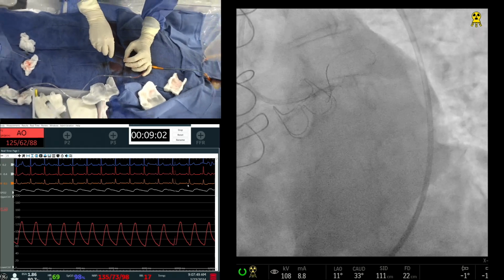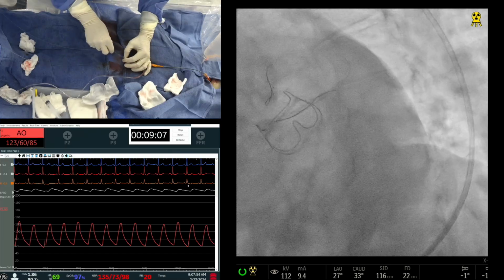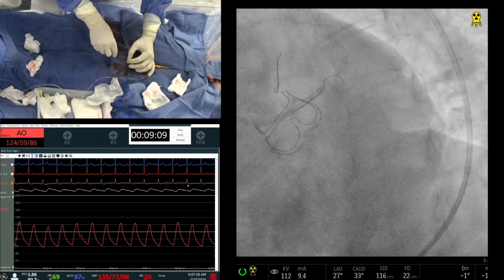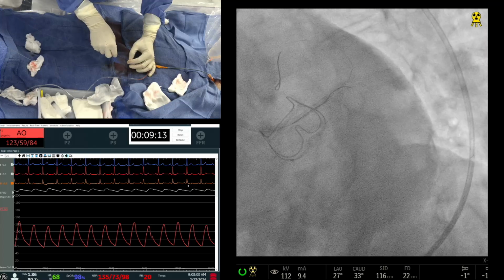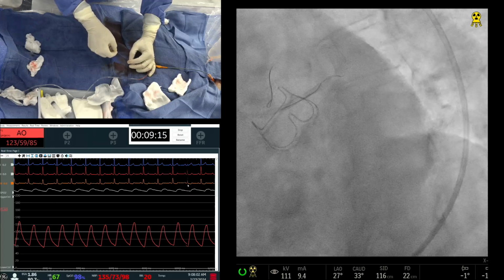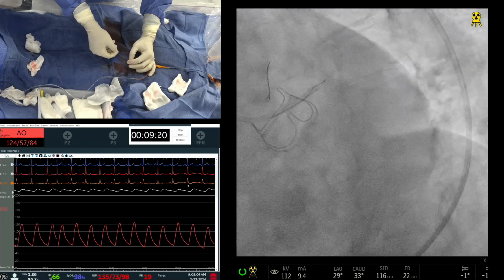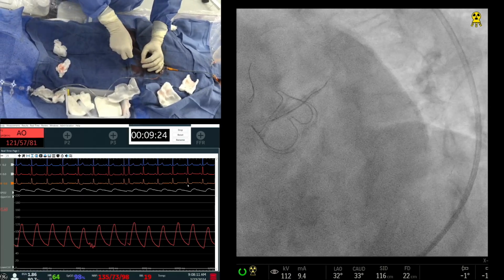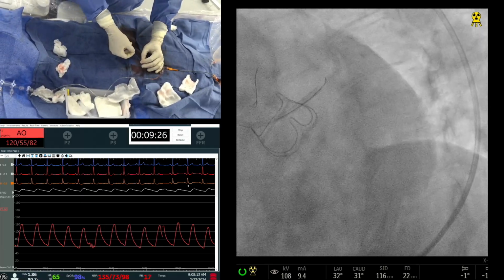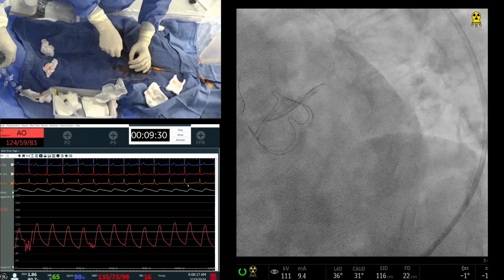So for the beginners, what precaution would you suggest for Rota towards the circumflex? LVEF is fine. Grossly undersize the burr, and if there's not much calcium, avoid the rotablation going to the circumflex. Nothing wrong in that. And then later you can just do the IVL if necessary. That's it. Undersize the burr and use the IVL if necessary for the circumflex.